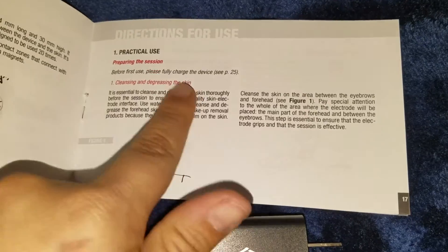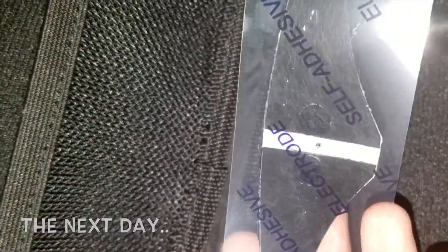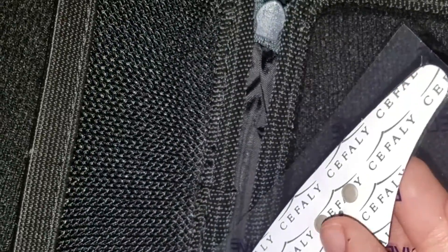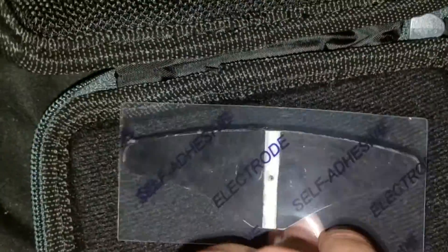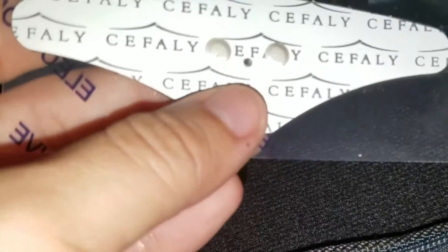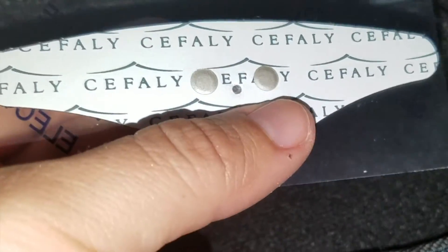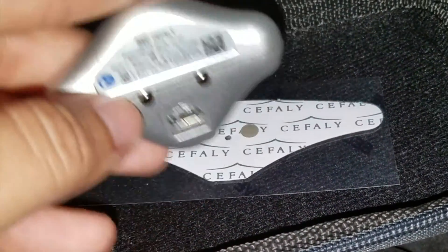The directions say it has to be fully charged before use. So I charged it all night to make sure it was fully charged. This is how the electrode looks when you take it out of its package — it has two places to use for the magnet to grab onto. It's pretty sticky, so let's see how it does on my actual head.